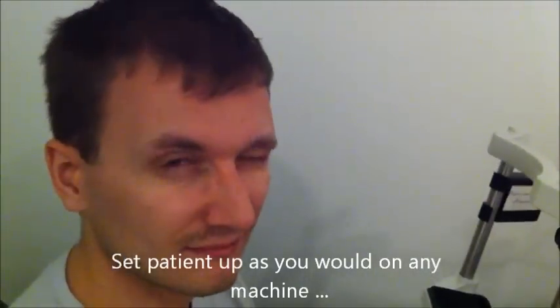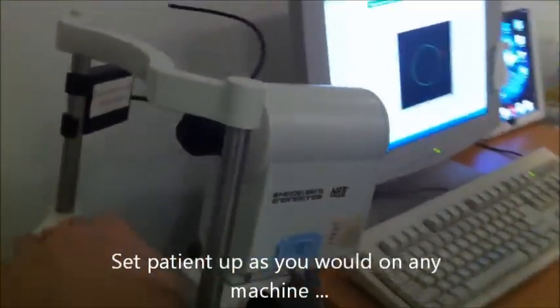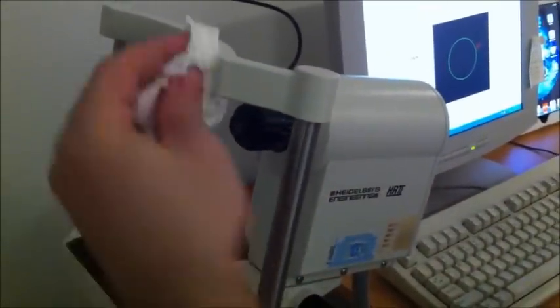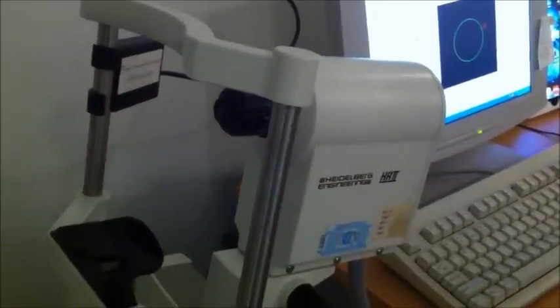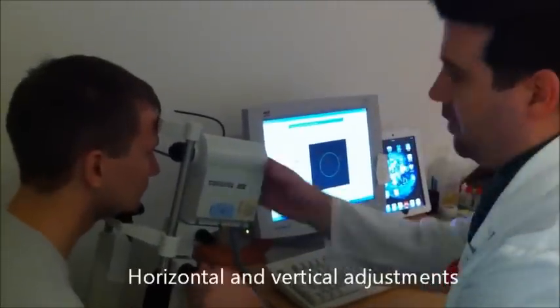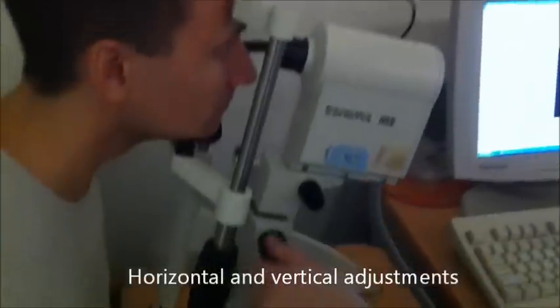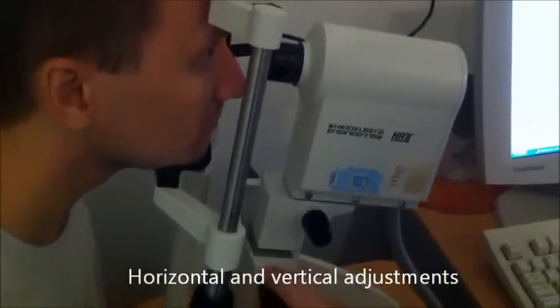The procedure's pretty straightforward. The actual scan usually only takes about 10 or 15 seconds per eye — it's pretty quick. You set this up the same way as you would with a slit lamp; you want to make sure the patient's comfortable. I'm just going to get you to pop your chin up there for me. When starting the machine, you can adjust the horizontal axis finely with this control, and you can go up and down with the wheel here.